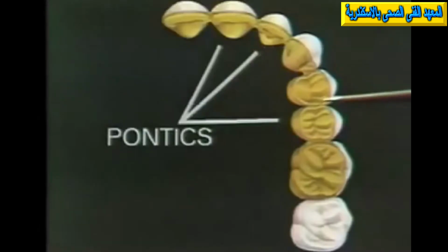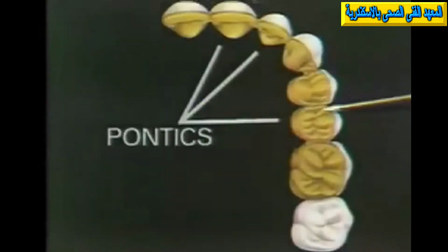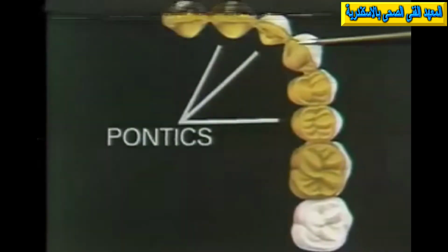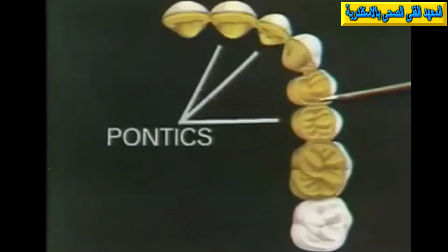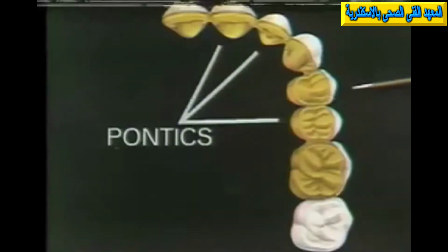The interposition of a semi-rigid connector at this point could be used to reconcile draw problems between anterior and posterior abutments if they existed. It facilitates at the time of cementation because the bridge can be cemented in two separate sections. It might also be helpful at a later point of time should anything go wrong with the posterior part, which could be removed and remade without disturbing the anterior section of the bridge.